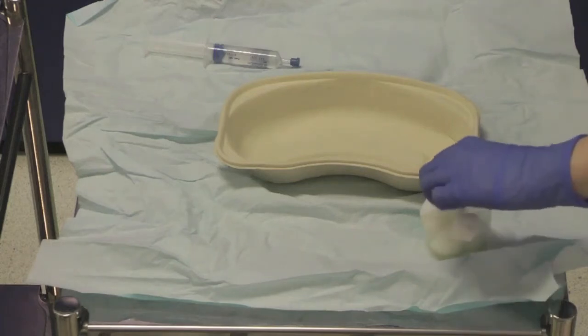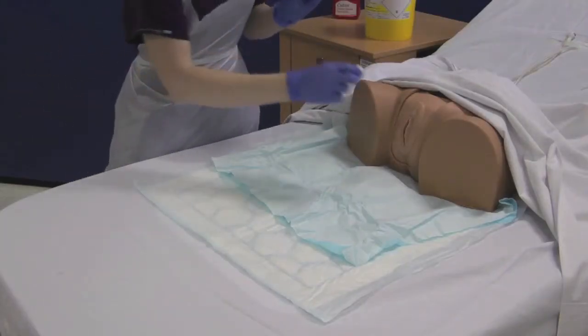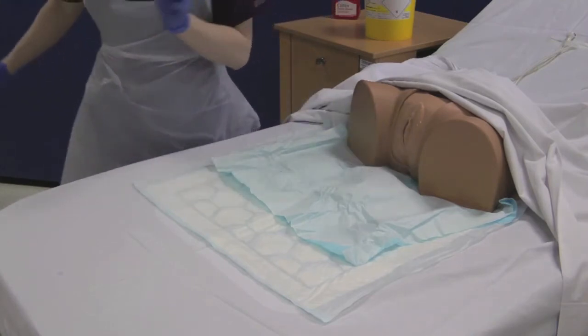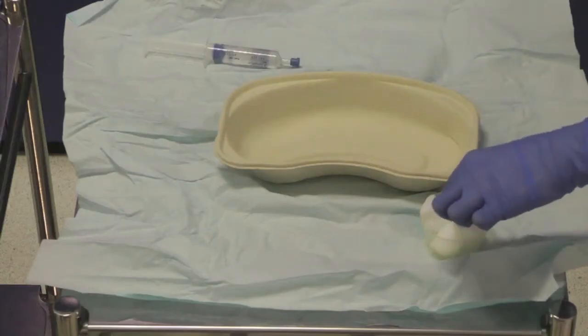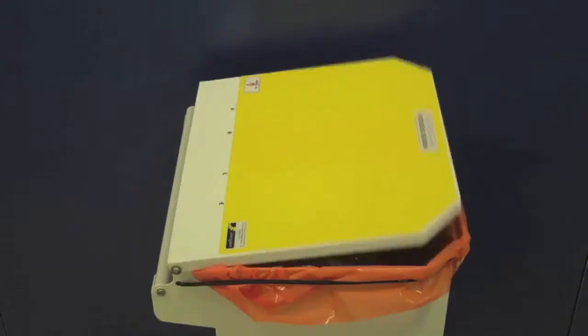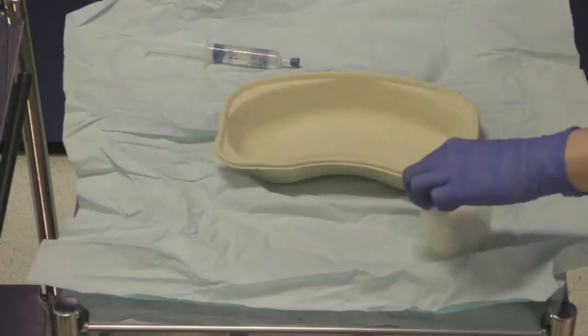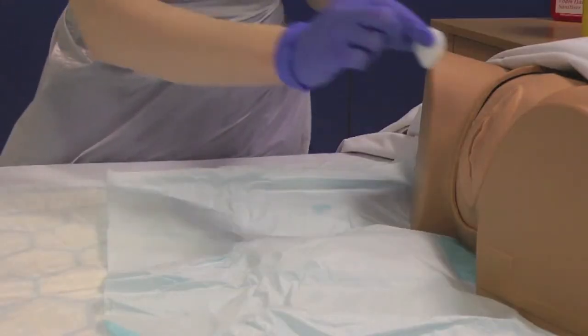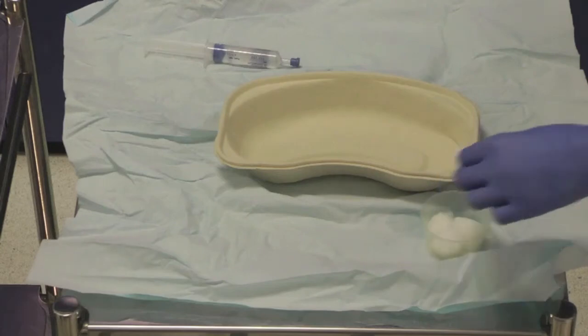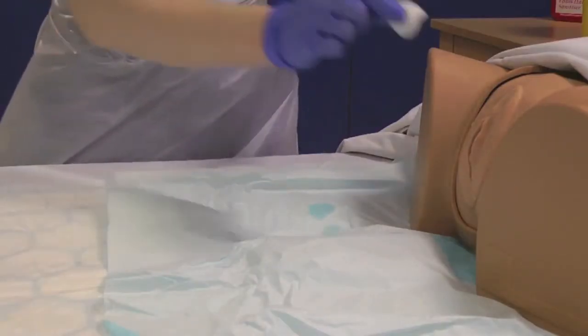It may be necessary to part the labia at this point using the sterile swabs. UHL policy utilizes a clean hand, dirty hand technique as demonstrated here. Use your clean hand to pick up the sterile cotton wool balls and pass them to your dirty hand. This ensures that your sterile field is not contaminated. The dirty hand is the only hand that touches the genitalia.